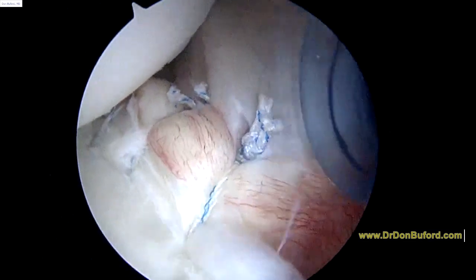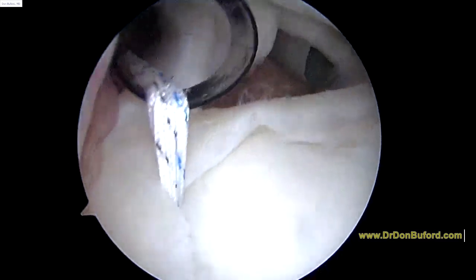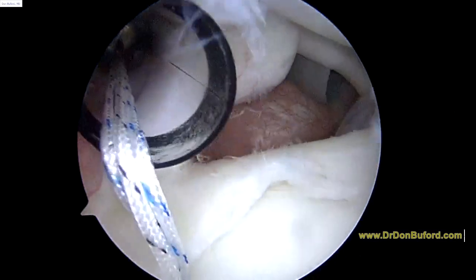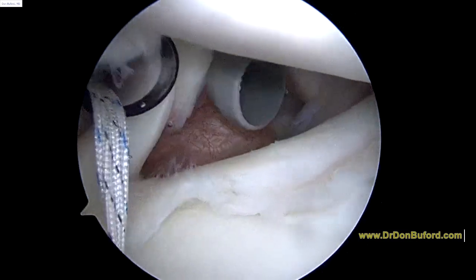Now we're going to get to work on the SLAP lesion. Just placed a suture anchor right in front of the biceps. You can see it's got two sutures on it. And this is what allows us to fix the SLAP lesion. So it's just a bigger version of the anchors we've already used for the posterior reconstruction.